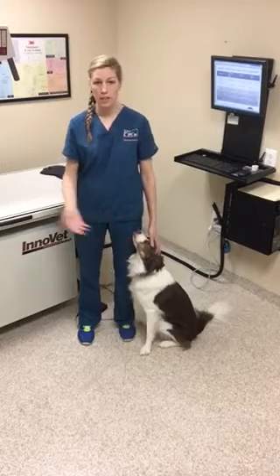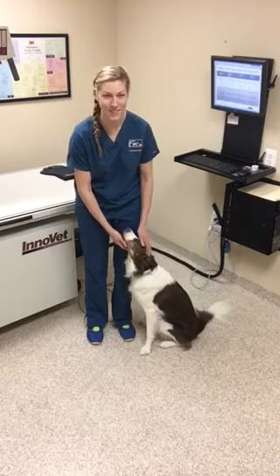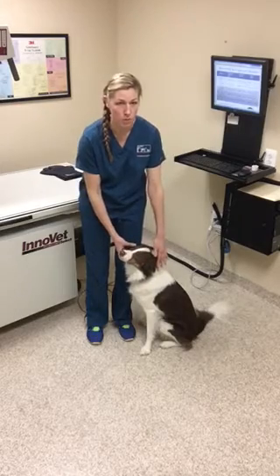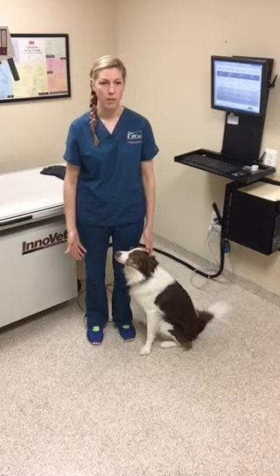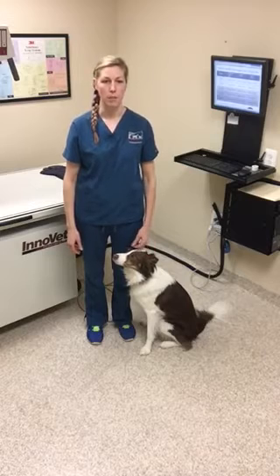The patient should be placed on the table in lateral recumbency. However, Huck does not want to get on the table. You would lay him in lateral recumbency and measure at approximately the 12th rib using calipers. It is important to measure the patient while in the same position used for the radiograph. If our patient were measured while standing, the tissue thickness would be greater than when the animal is recumbent.